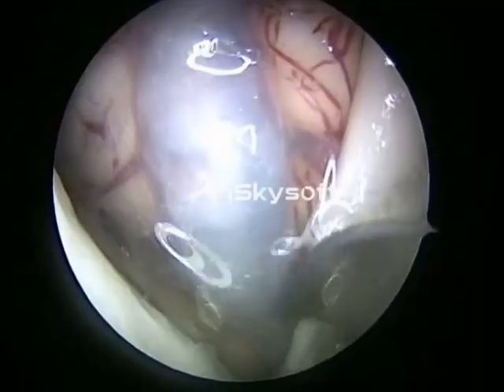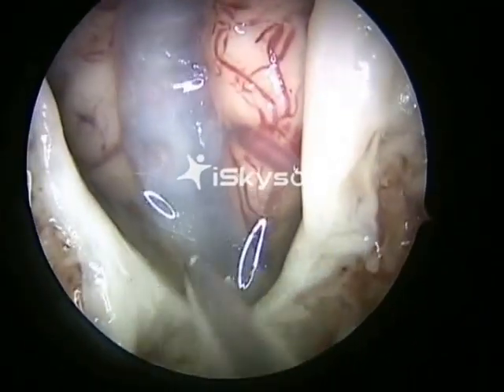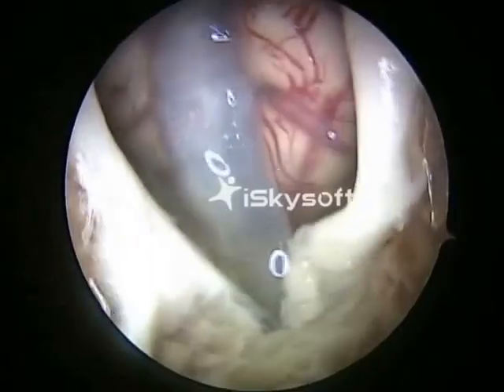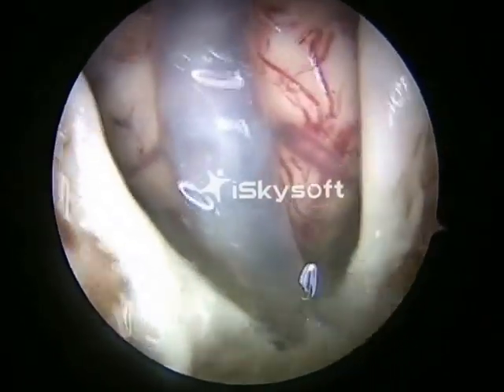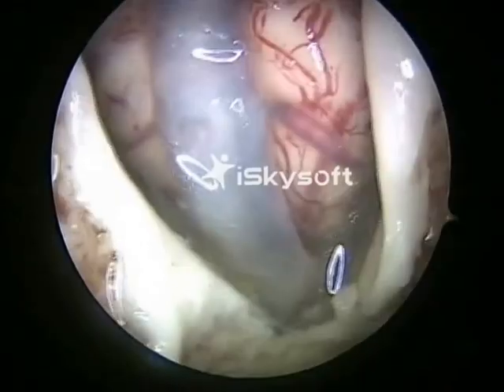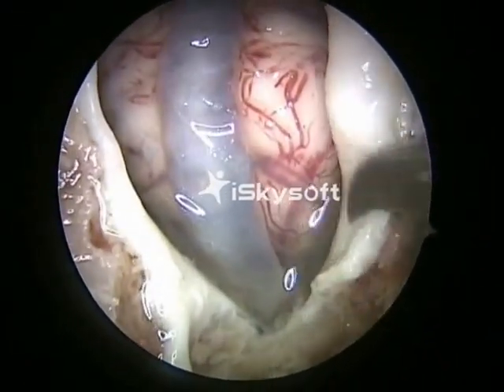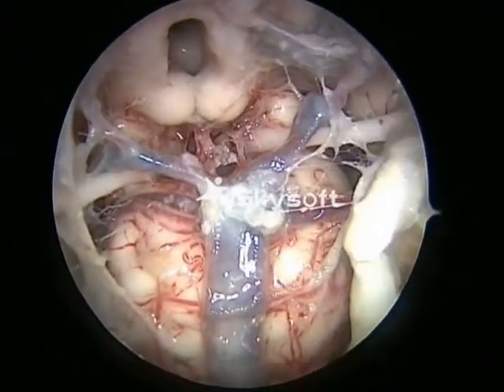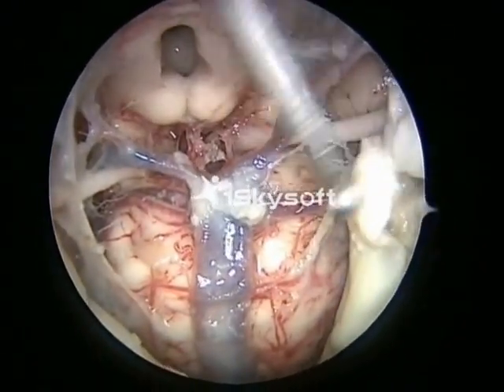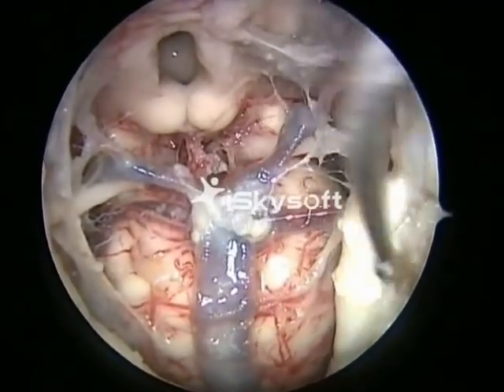In a live situation, it's better not to take off the arachnoid, but here in the cadaver, we would like to take off the arachnoid layer and show the anatomy better. That's the arachnoid being teased out. You can see the third nerve, the posterior cerebral artery, the PCOM, the P1 and the P2.